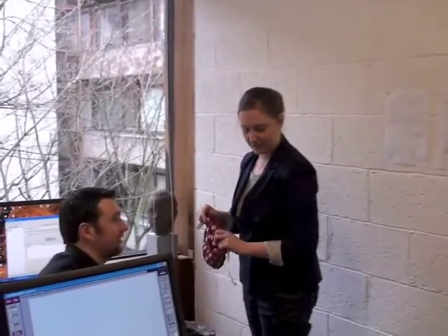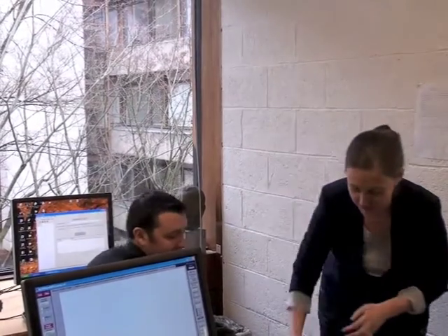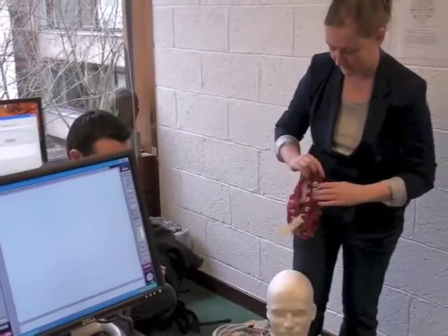So I'm going to beautify Bren here. You can do that while it's on me. Do you want me to do it first so you won't be sitting? Okay, maybe then I'll do this first, before I put the cap on Bren.